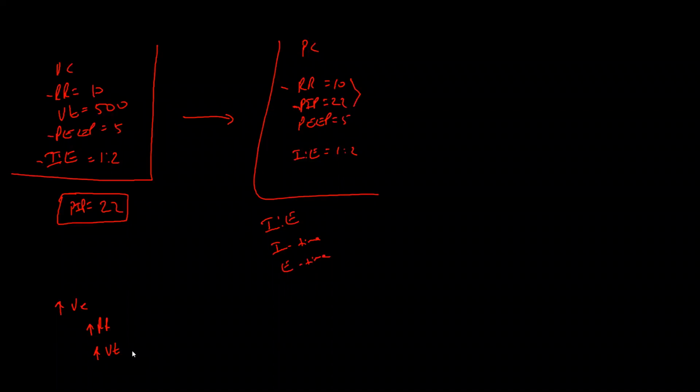They're hard to expand. And what happens on your volume control, to maintain this tidal volume of 500 cc's, you're going to see your peak pressures go from 22 to 26 to 28 to 30 to 35 to 40. You see what I'm seeing here with this trend? Well, we know when we get above 30, this is dangerous.